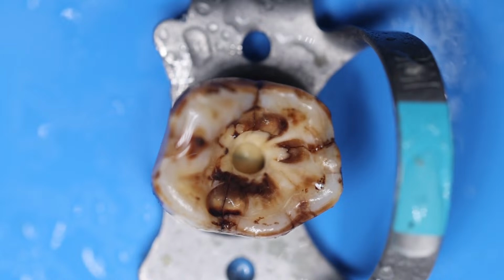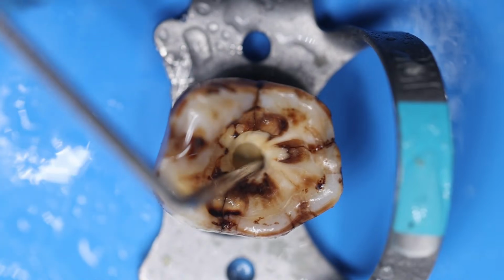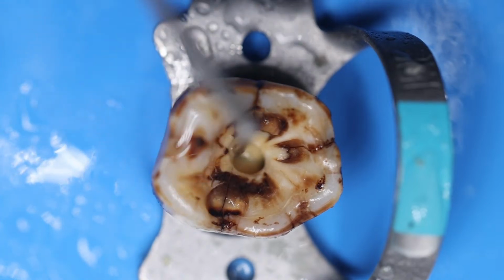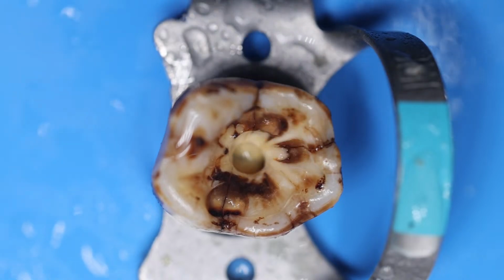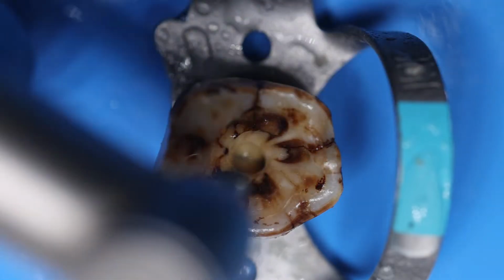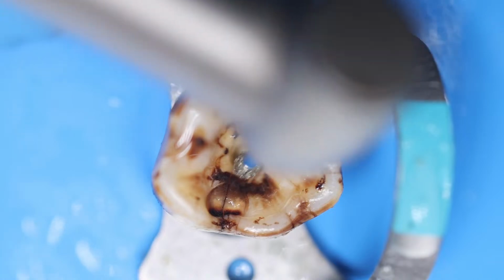Now you can use the DG16 probe to see if there was a drop. Yes. So we just obtained the drop and now we can expand this area. We are not switching any bar, we are just using the round bar and we now need to expand this area. Do not go deep, otherwise you may lead to perforations.